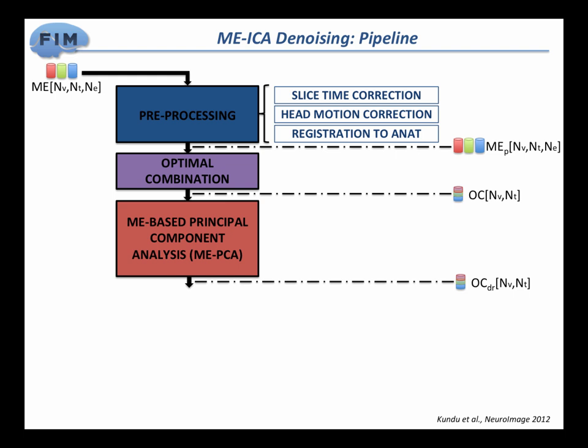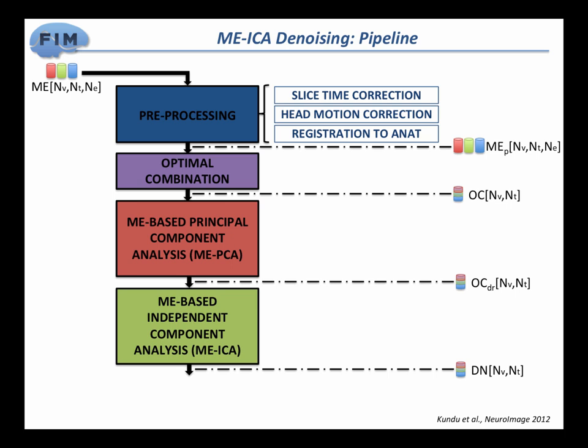to estimate the dimensionality of the data, basically how many components. This is normally done when you do a normal ICA. There is always a PCA first to estimate the dimensionality and to get rid of random noise, and then there is the actual ICA. So this works the same way, with the only difference that in both the PCA step and the ICA step, the selection of the components is not based on the amount of variance explained, but based on the kappa and the rho.